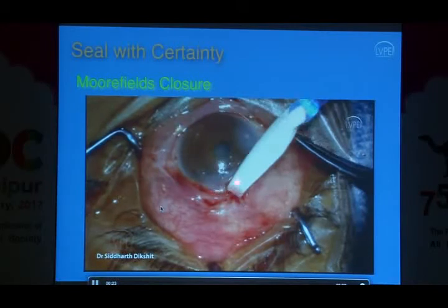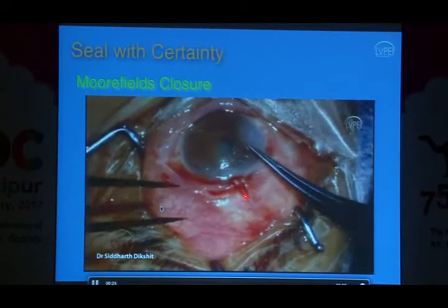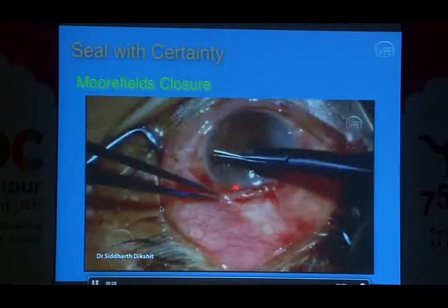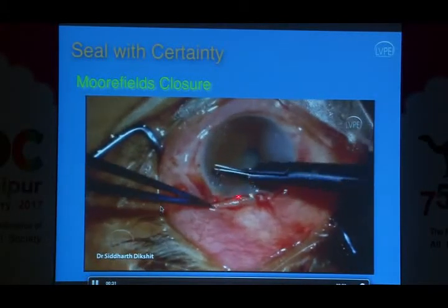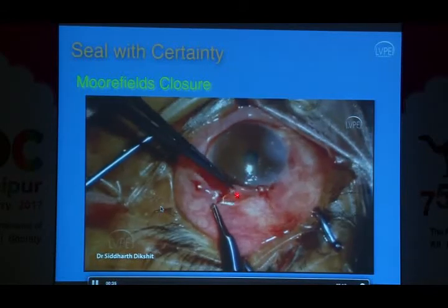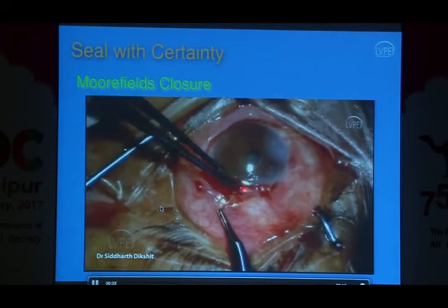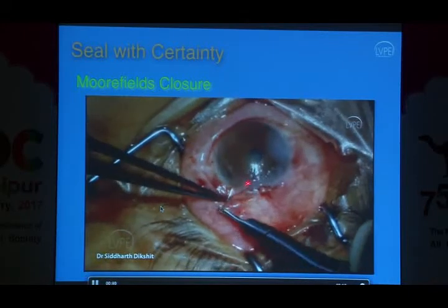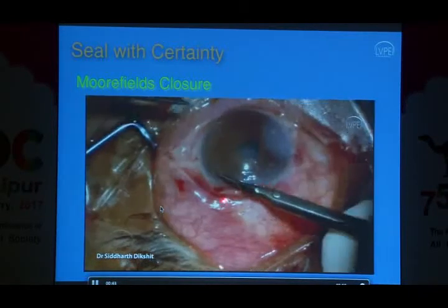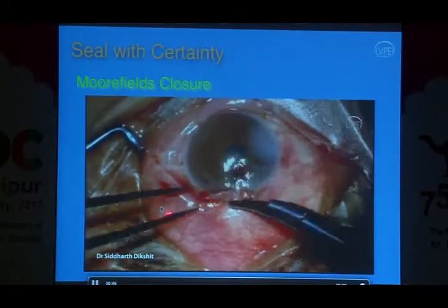Now, this closure is right at the limbus. It does not go into the cornea. It's there at the limbus, and that creates an apposition with the natural landmark. So there are 2 sutures at the edge which need to be purse string kind of suture. And if the incision is not very large, the central suture can just be a single horizontal mattress suture. And this gives you a closure continuously along the thing.